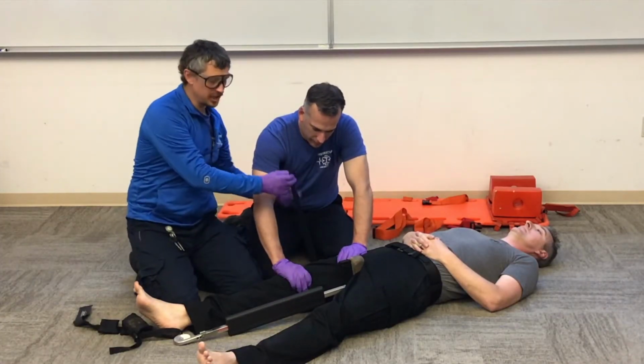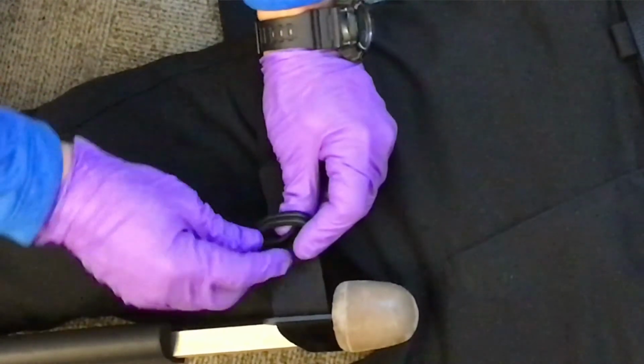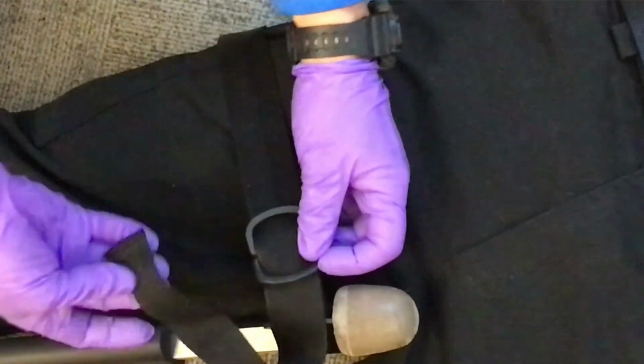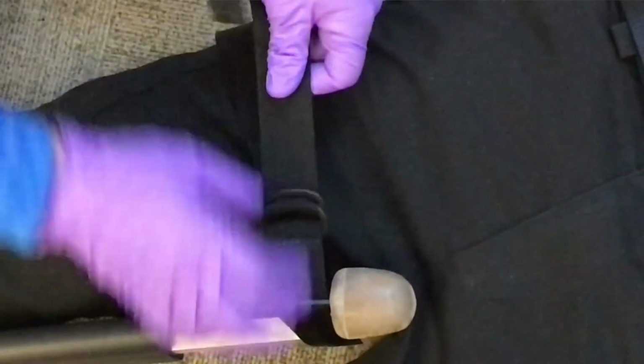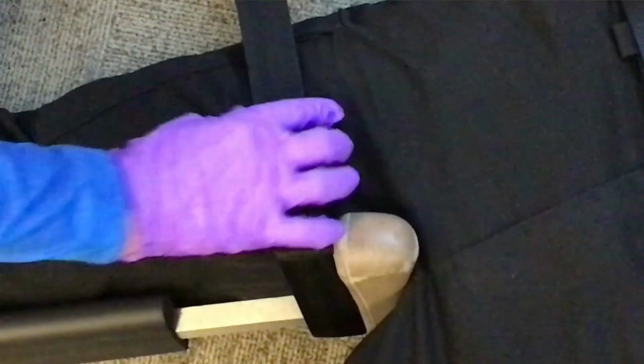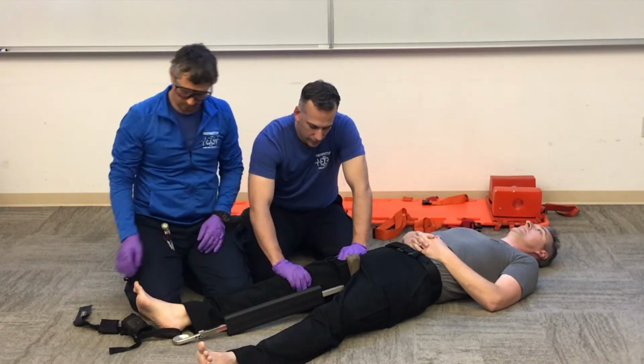This is going to be our ischial strap. Our ischial strap is designed just to hold the device to the leg. We want to make sure that our buckle is on top of the leg and not hidden under the leg so that we can tighten the buckle.